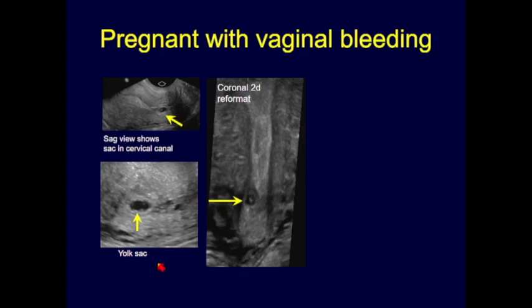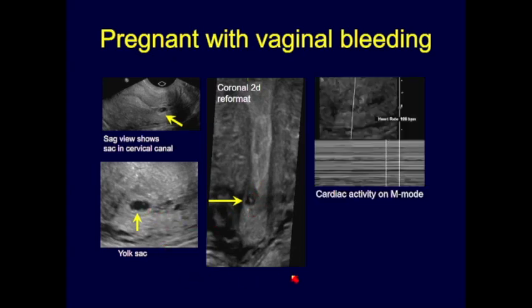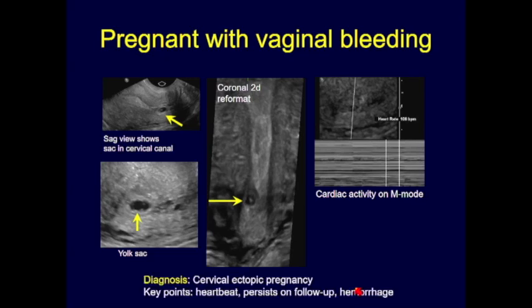A different pregnant patient with vaginal bleeding: a low-lying sac located in the endocervical canal, below the internal os on coronal 2D reformat, with a yolk sac and M-mode cardiac activity — this is a cervical ectopic pregnancy. If there's a heartbeat within the embryo, it must be implanted at that site. This is often confused for spontaneous abortion in progress, but cervical ectopics will persist. It's important to diagnose early, because a D&C can lead to significant hemorrhage — there is no muscle in the endocervical wall to stop the bleeding.